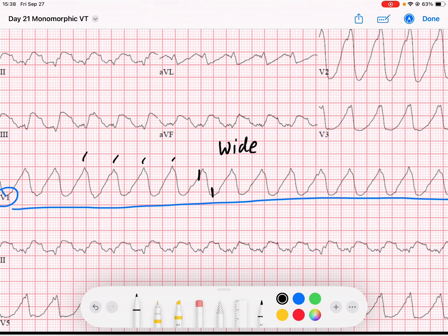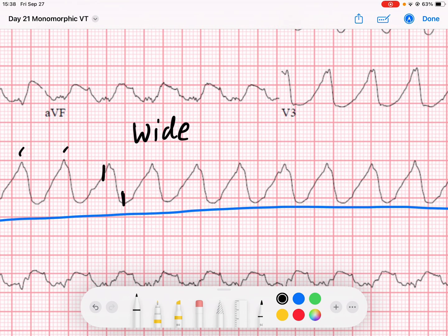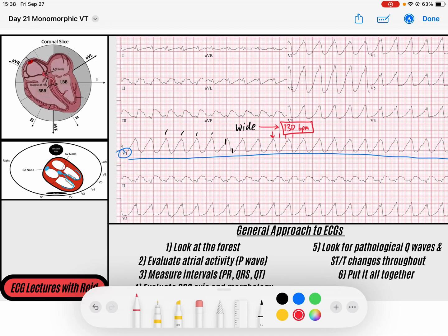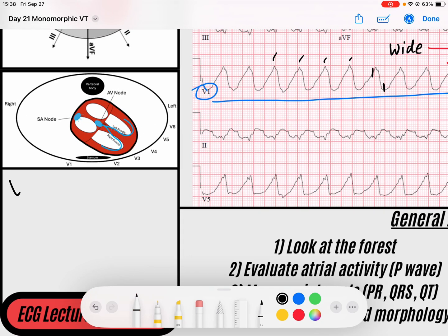This is occurring at a pretty quick rate. Let's take a look at a QRS that lands on a solid line. The rate is 300, 150 — this will be 100, so somewhere between 100 to 150. We'll call this 130 beats per minute. So we have a wide complex tachycardia at 130 beats per minute. Our job is to determine: is this VTAC, like we're looking at here, or is this SVT with aberrancy?